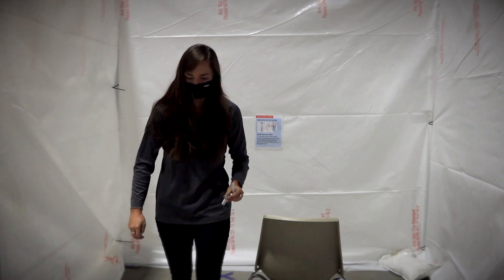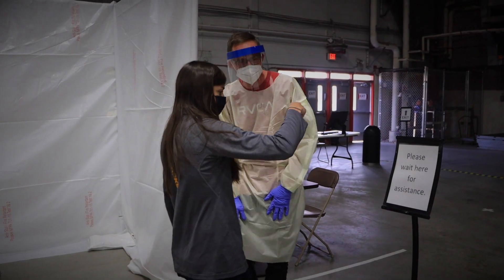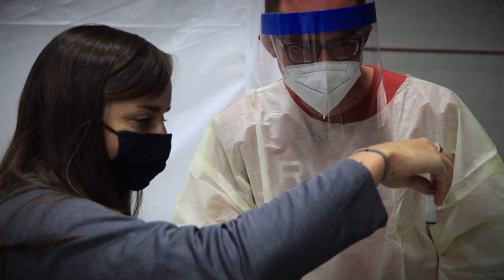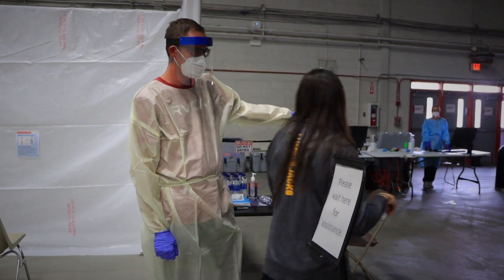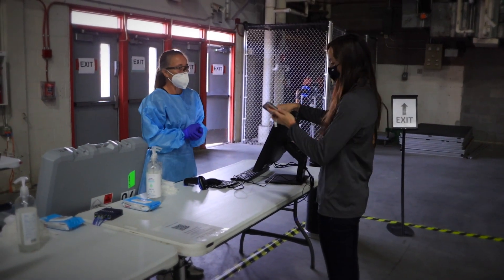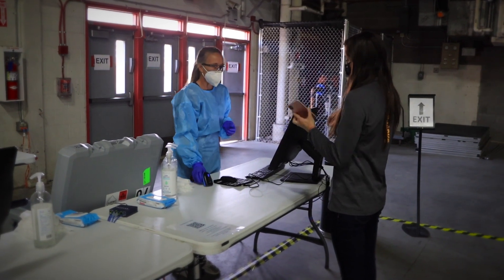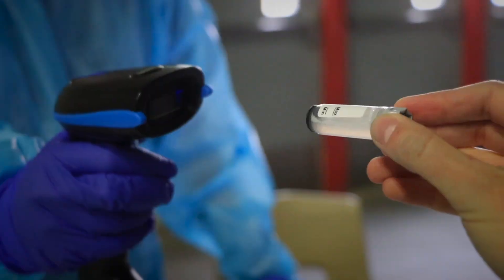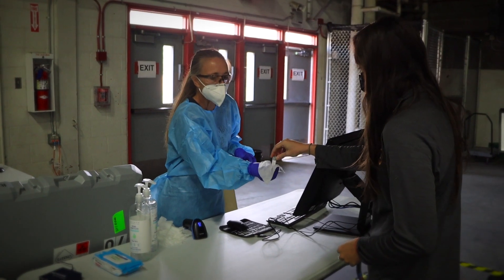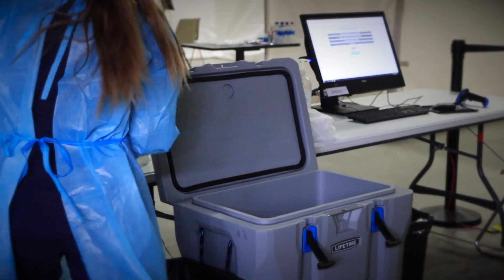Then proceed to the next station. There, someone will analyze the saliva and make sure it is a good sample. If you get the thumbs up, proceed to the checkout. Have your QR registration code handy to allow your information to easily be uploaded into the system. Double-check that the lid is screwed on tight before your test tube is scanned and hand it over. Your sample will be safely stored as it makes its way down to Phoenix for processing.